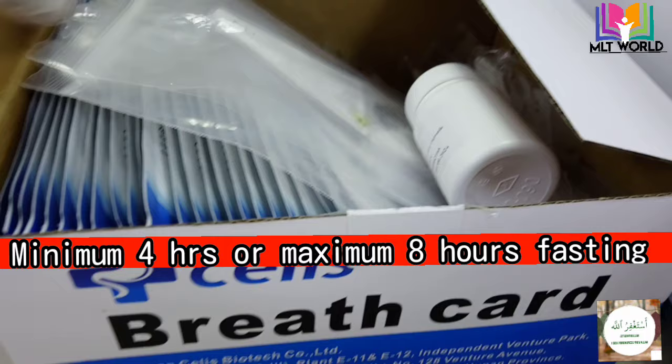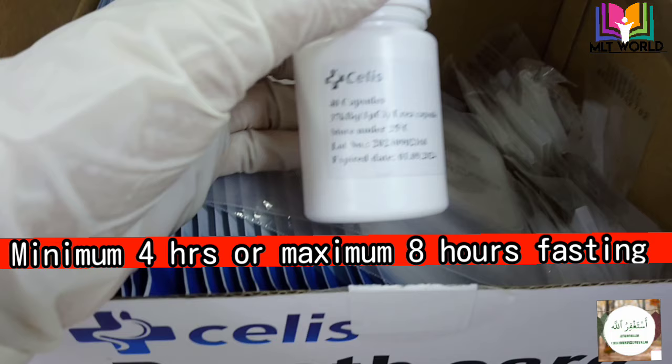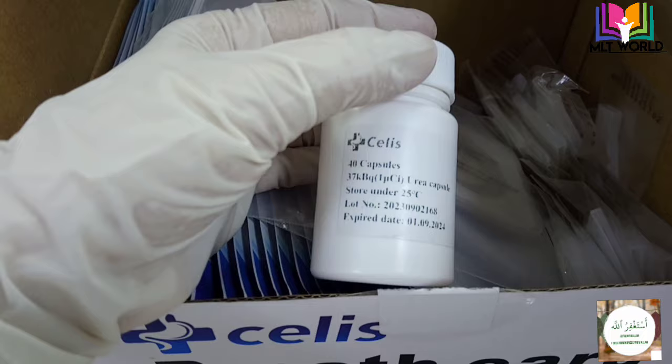First of all, for the urea breath test the patient must fast for a minimum of 4 hours or a maximum of 8 hours. After that we will give this 14C capsule to the patient.